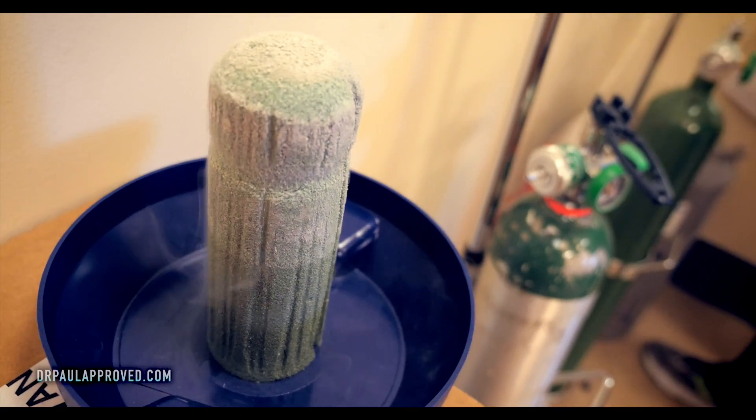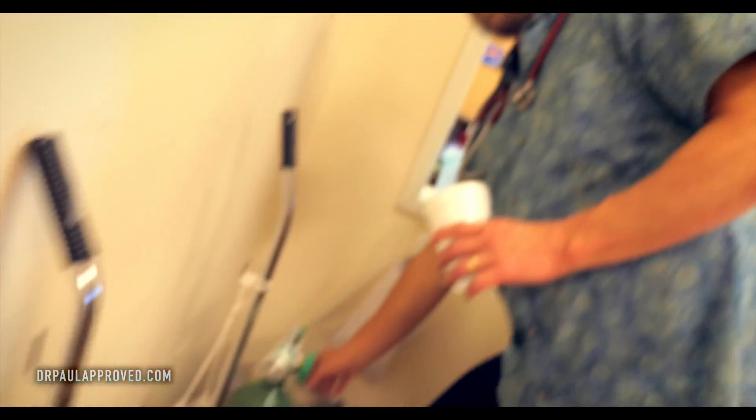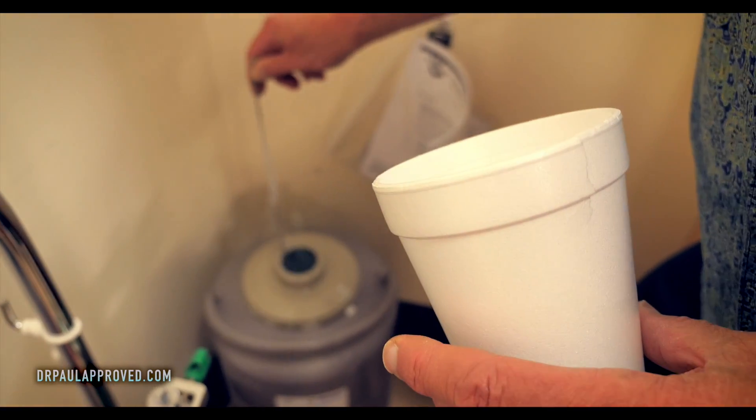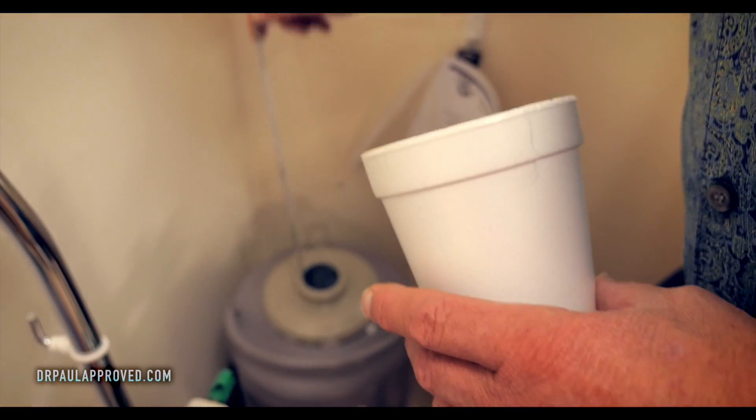The only good use for styrofoam is to put liquid nitrogen in — otherwise this stuff fills up landfills and never breaks down. It'll be there for tens of thousands of years, so they say. And we have a little ladle. I used to be coordinated enough to get that.